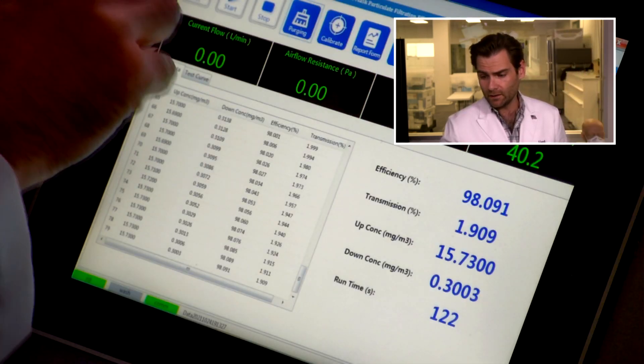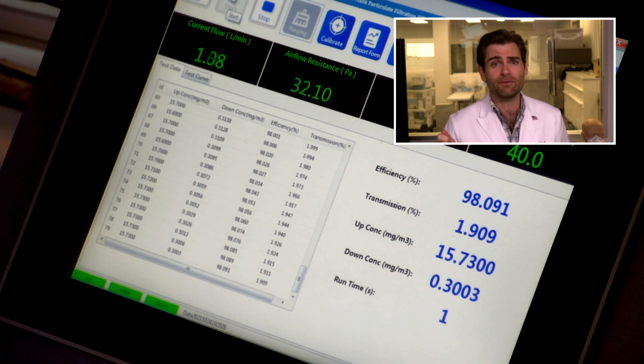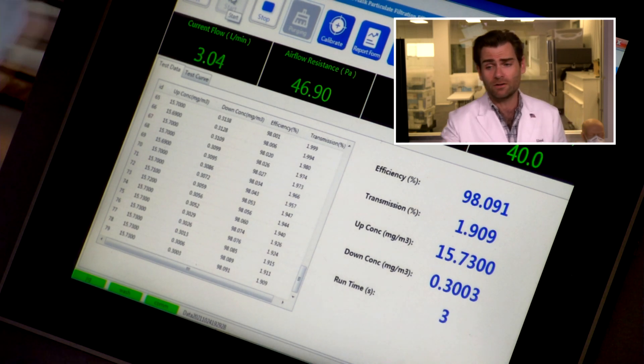Okay, let her rip. This is a PFE machine — particulate filtration efficiency machine. We are doing the NIOSH-style N95 test here today. We're not doing this setup exactly like NIOSH would, but we are using NaCl, shooting that through the mask and seeing how much it catches on this machine.